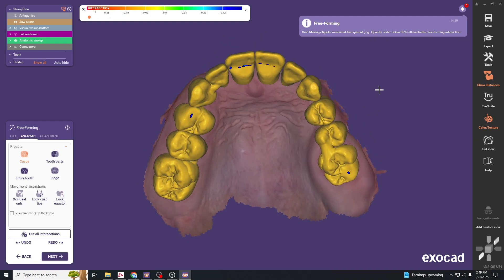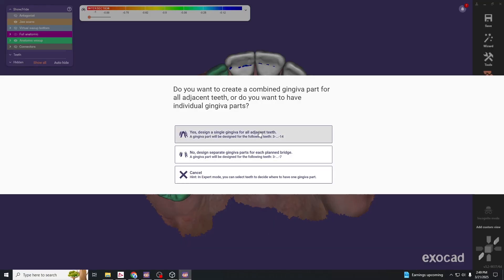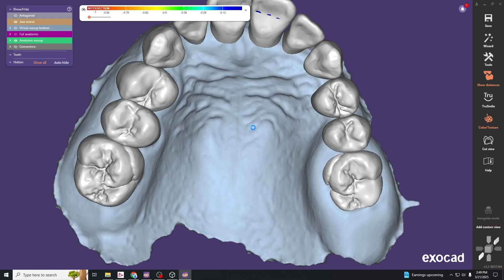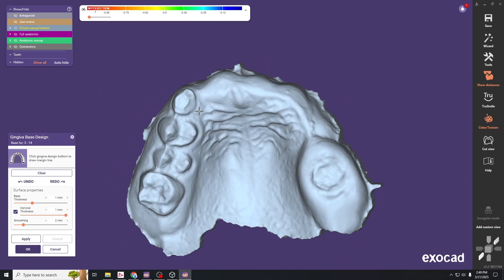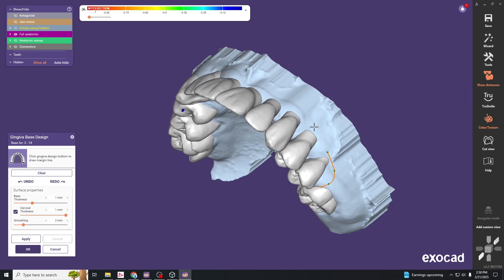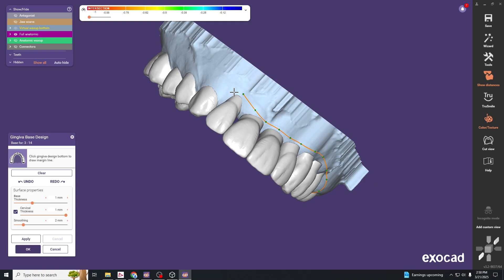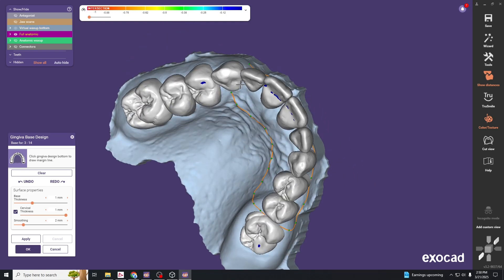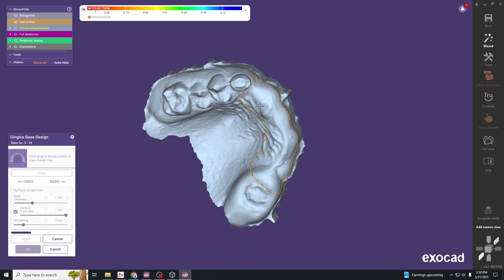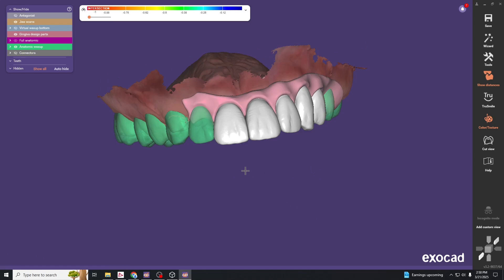Now we can add soft tissue. Go to expert mode, scroll to the bottom, click gingiva base design, and select gingiva for all adjacent teeth. Click onto the areas where you want soft tissue. On the lingual, have it come onto the palate a bit for support. For aesthetics, follow the necks of the teeth and draw your line over the top. Double-click to close the loop — this adds the soft tissue that will link all the individual pontics together since we have no connectors between them.